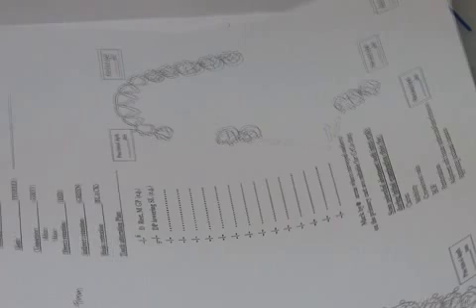So this case shows you, first of all, how important teeth are for the elderly. It's part of their personality, it's part of their self-value, self-esteem. So it's not a clear decision, it's not a quick decision. You have to try to think about provisions for extraction. Any teeth that might be extracted later, I do what we call provision for extractions, meaning that I design my partial denture in a way that I could extract the teeth later on and add teeth easily to the RPD without changing the full thing.